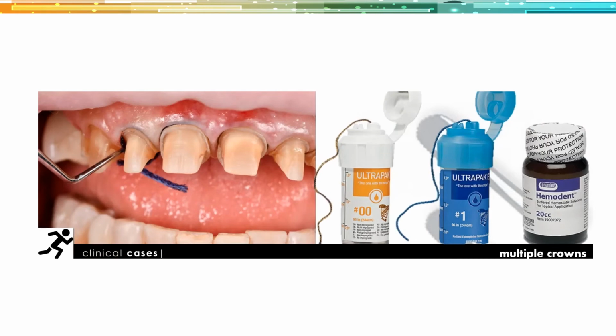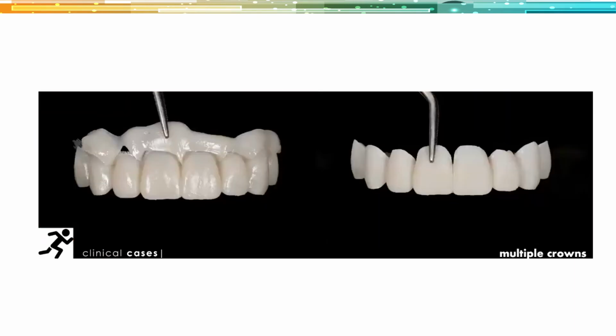This is really where the predictability comes into play. For the predictability of the fit of the restorations, the current generation of scanners, including the TRIOS, depend on the scanner being able to see your margins. So soft tissue retraction is of paramount importance even today. I'm not going to tell you how to do it, because you can use cords, paste, or lasers, depending on who you speak to. I tend to gravitate towards using two cords and Hemodent. It seems to be a very predictable way for me to work. While the cord is sitting, I'm going to start trimming and polishing the provisionals.